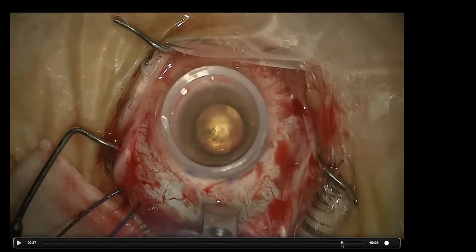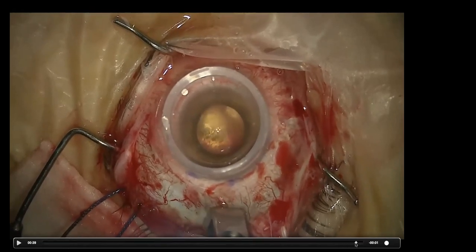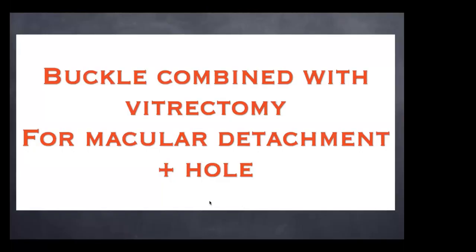It's easy to move the buckle and see exactly where it is. If it is under the macula, then the surgery is over, basically. It's done. It's a 20-minute surgery.